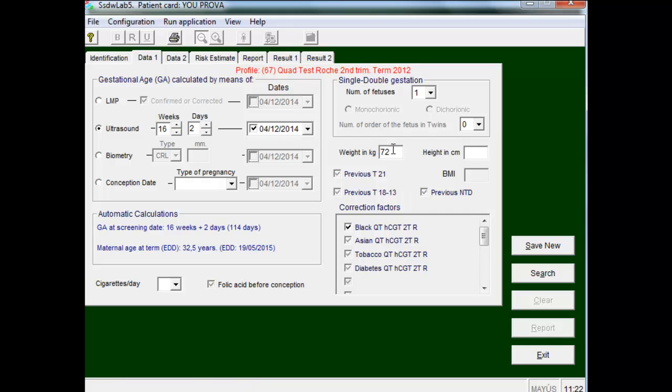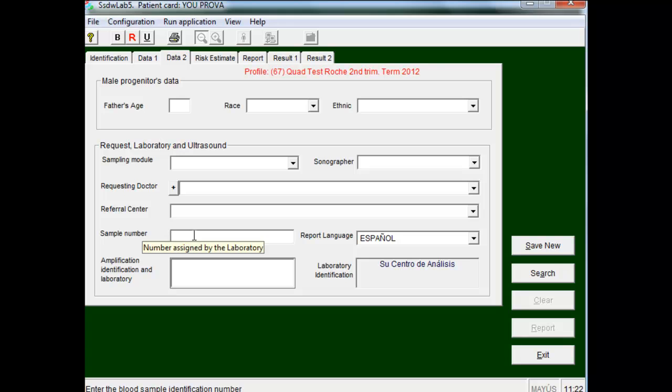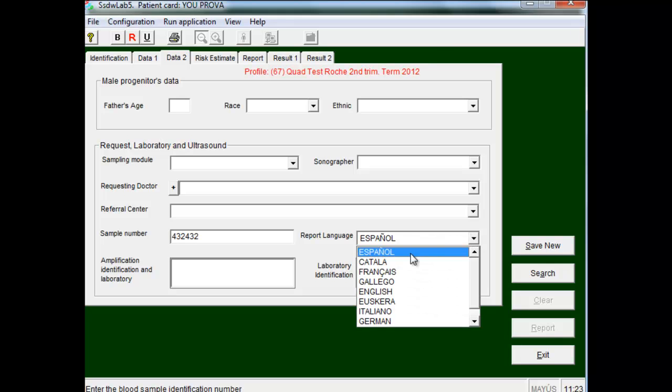On the next screen, or in the following folder, we can introduce, although not mandatory, the identification number of the analysis, and we can define the report language, which in this case would be English.